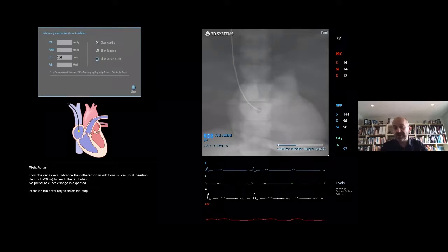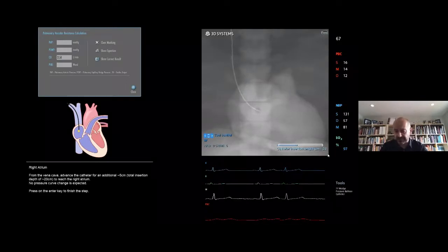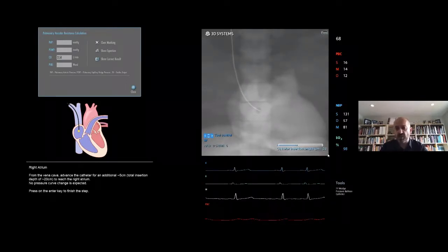The way you're doing this is you're really standing above the patient, above the neck, and you have to turn your head to the left like this and take a look at the monitor. You'll essentially see this very low, squiggly flat line. Another important thing is you've got to have the EKG on, which obviously you would have in the intensive care unit.